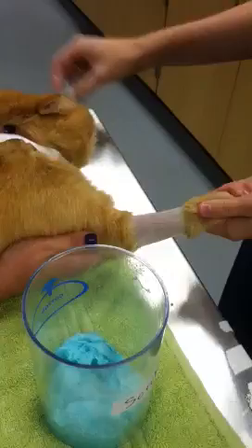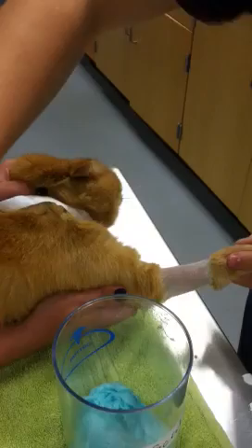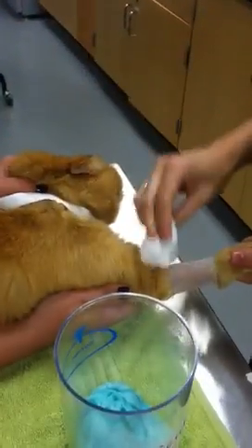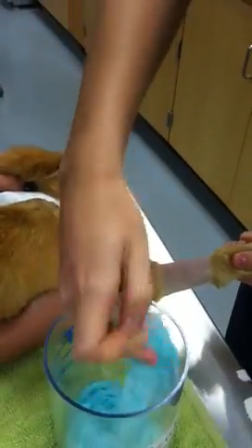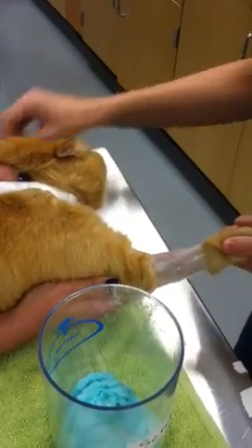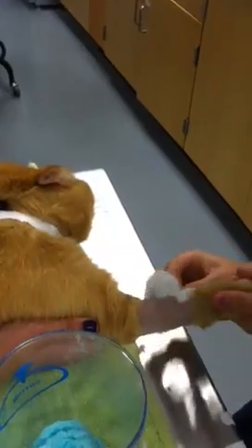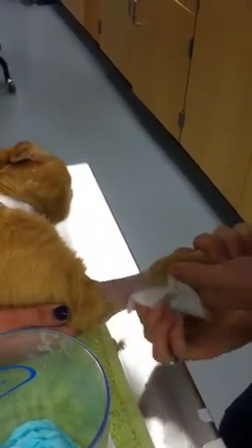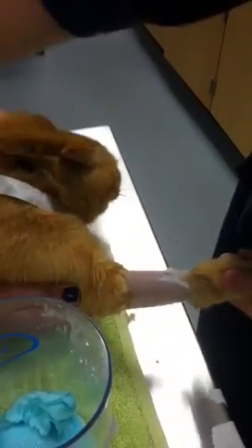We are being careful to never go back over the site after our initial scrub, and I'm following that with saline since you don't need alcohol to come after the chlorhex. Now I'm on to my third and final scrub to ensure complete sterilization.